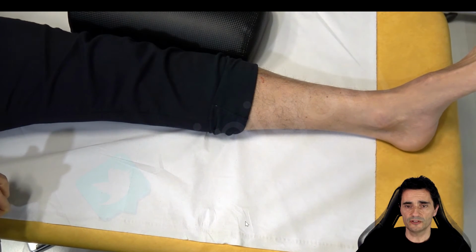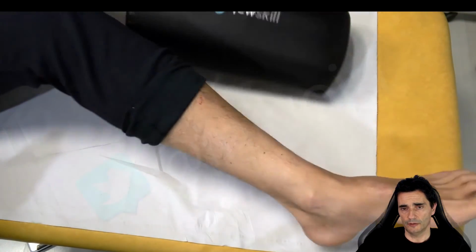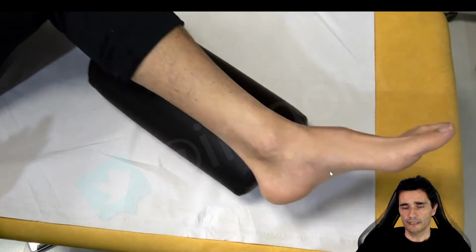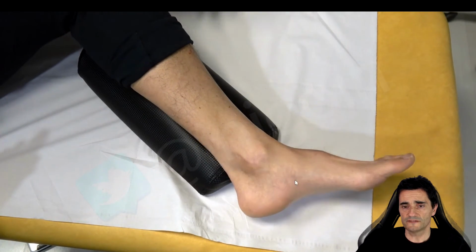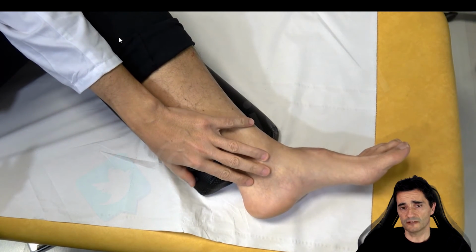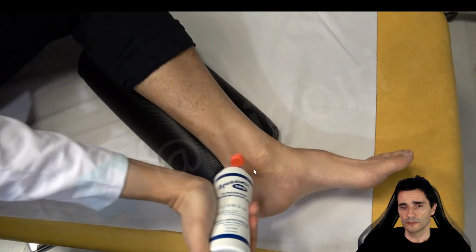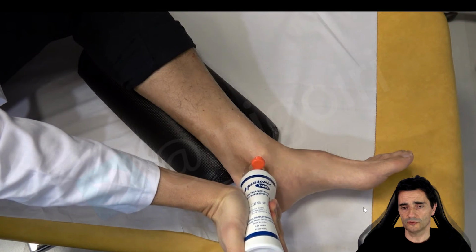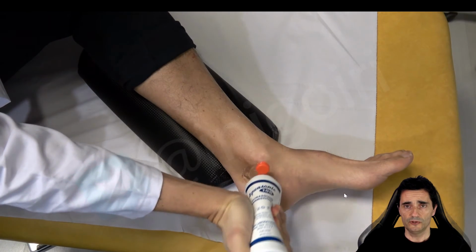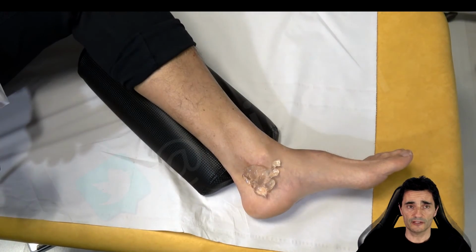And now we are going to check the ultrasound scan. To begin with, we will ask the patient to adopt a proper position. Usually I use a pillow below the leg, and the foot is free, and we achieve in this position, with external rotation of the hip, a good view of the medial side and a slight valgus of the ankle, and it's a good position to explore these structures. We use a generous amount of gel because we need to avoid bony contours and to help us with some structures.